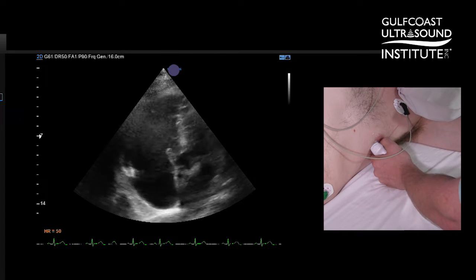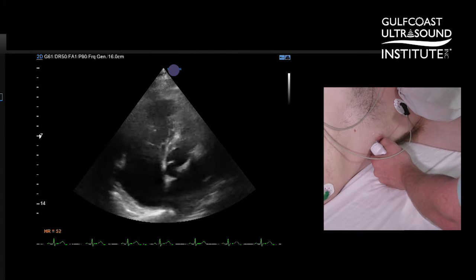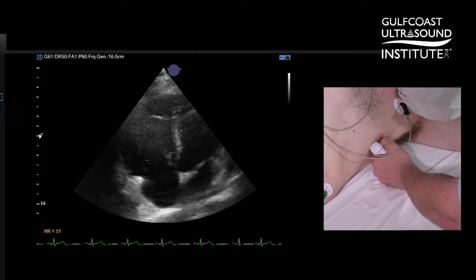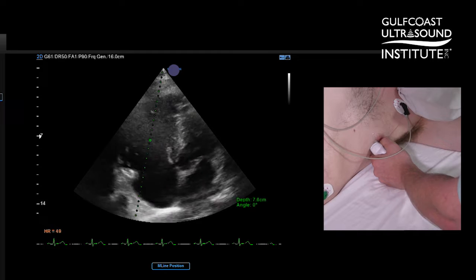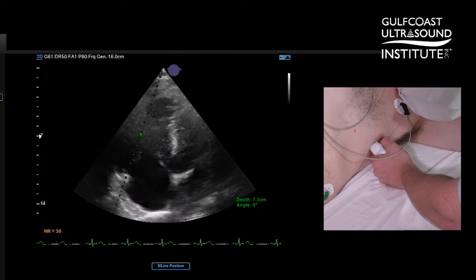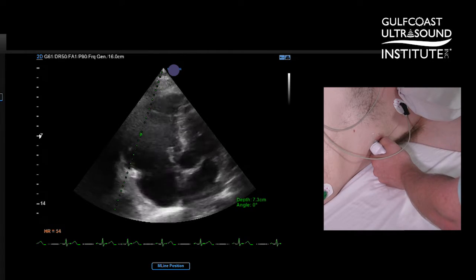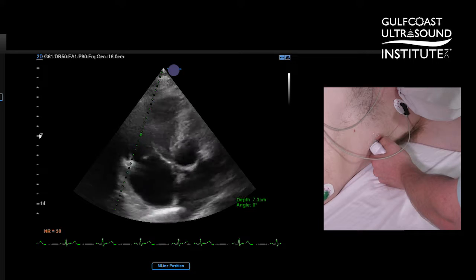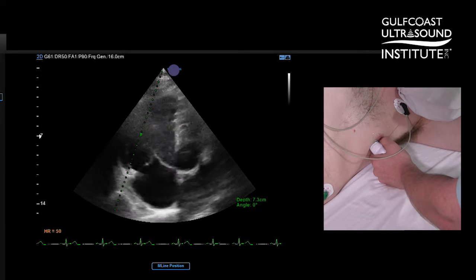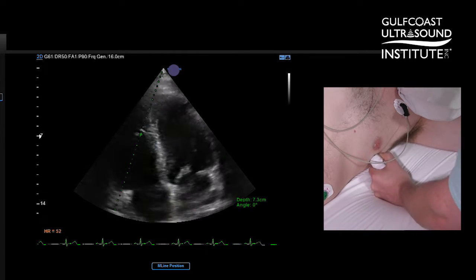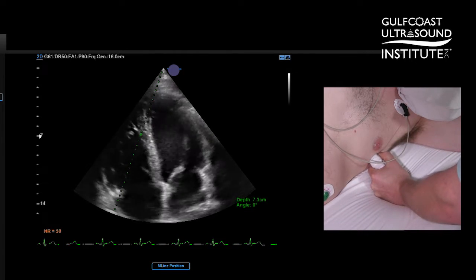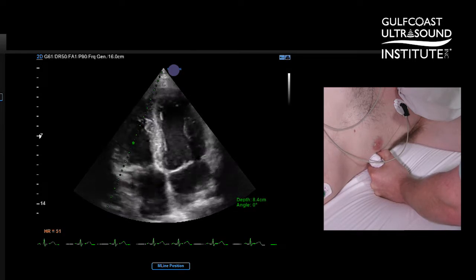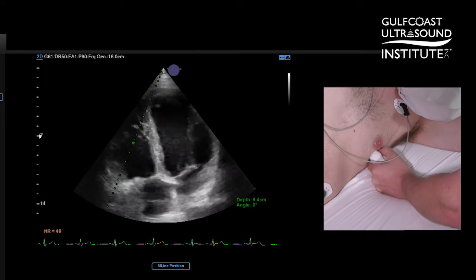TAPSE is the tricuspid annular plane systolic excursion, and it's an M-mode measurement. The reason for using this modified view is that our cursor is going to be much more in line with the motion of the RV free wall annulus.